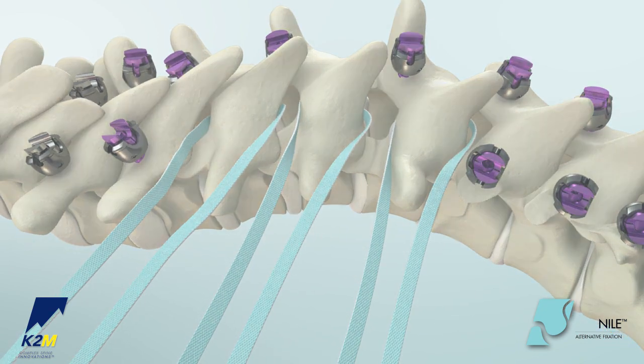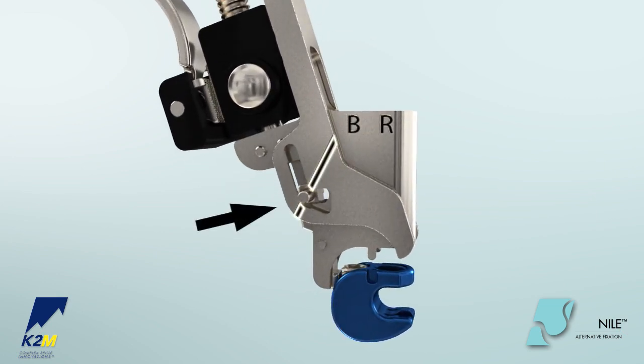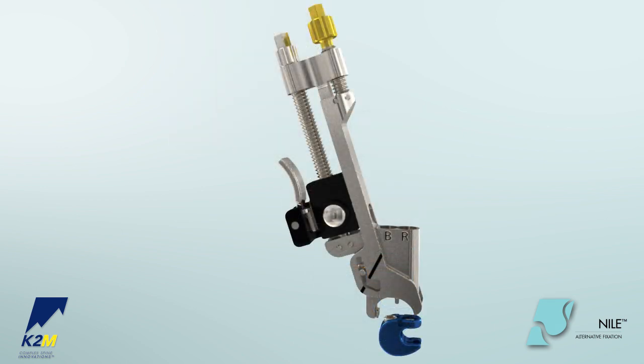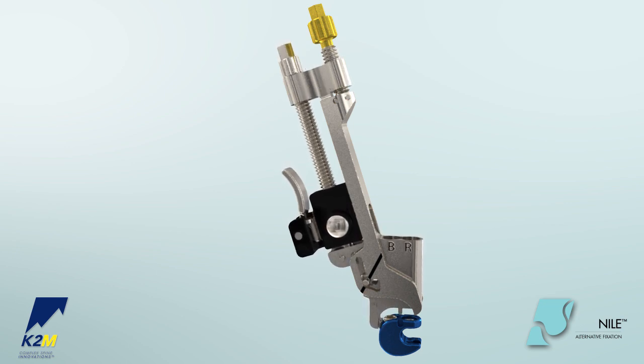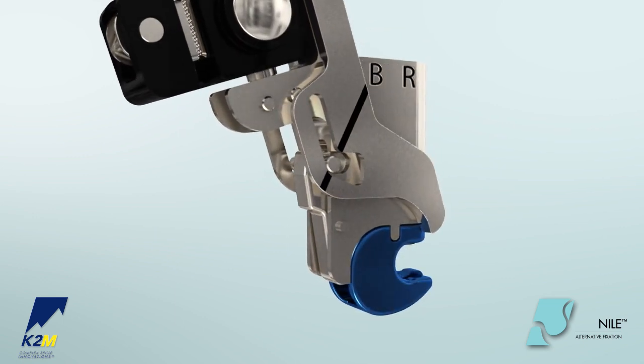Next, attach the clamp to the tensioner. Make sure that the pin above the feet of the tensioner is in line with the laser marking located on the sides of the claw. If the pin is not in line with the laser marking, turn the gold knob on top of the tensioner clockwise to bring the pin up or counterclockwise to bring the pin down. Push the tensioner down on the clamp. An audible click will be heard when the clamp is engaged.